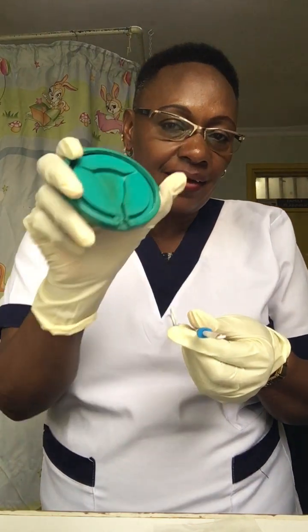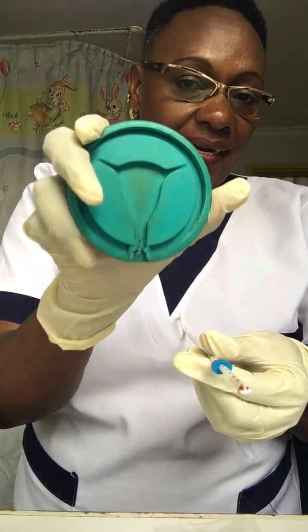Kindly look here. This is the IUCD, the copper T, the one we talked about, that is supposed to be fitted in the uterus.